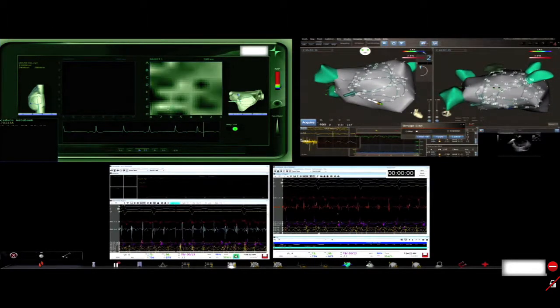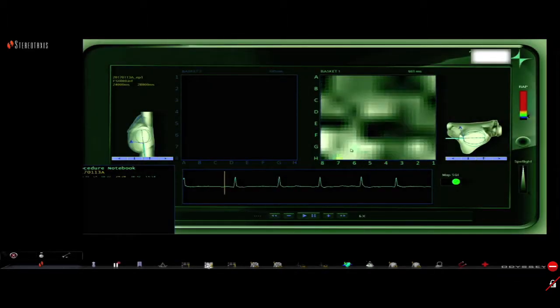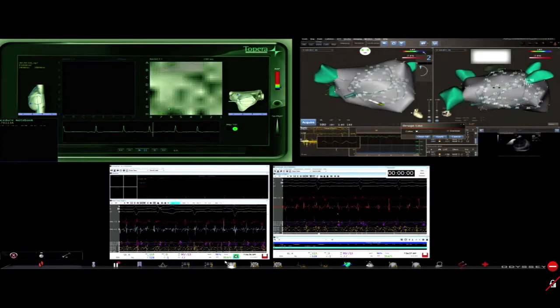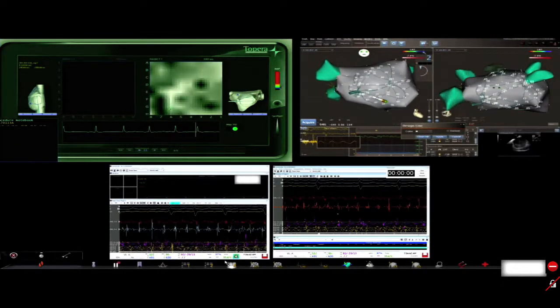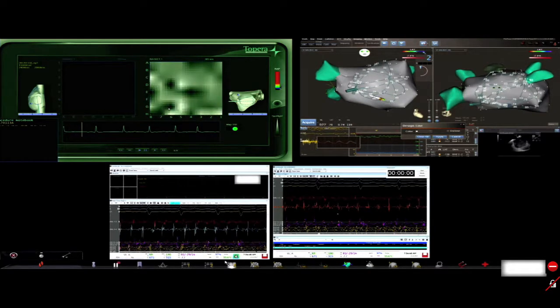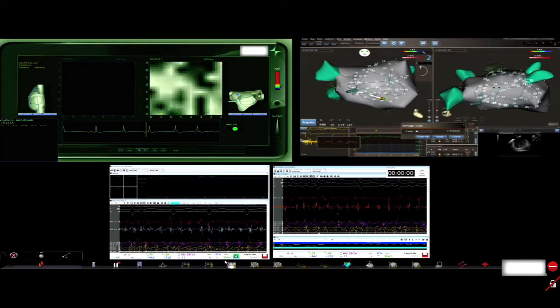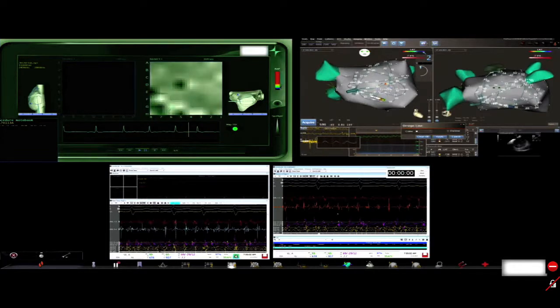On the grid, this projects as GH76. So that's what we're going to want to look at and find the corresponding area on CARTO. So 87, so those ports correspond to 66, 77, 86, 87. And so we're just going to define those boundaries. Typical areas are around 2 to 3 centimeters squared.